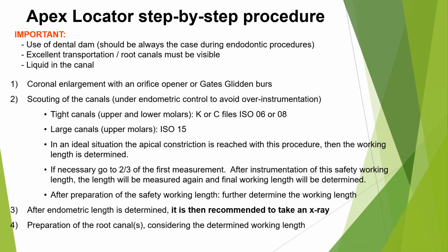So if you've got a patient that needs endo on 2 different teeth, for that first tooth, you would have the apex locator in the off position, unplug the lip clip connection, and then you turn it on and then you plug it in. That's right. And that's going to recalibrate the apex locator for that individual's tooth and from one patient to the next.